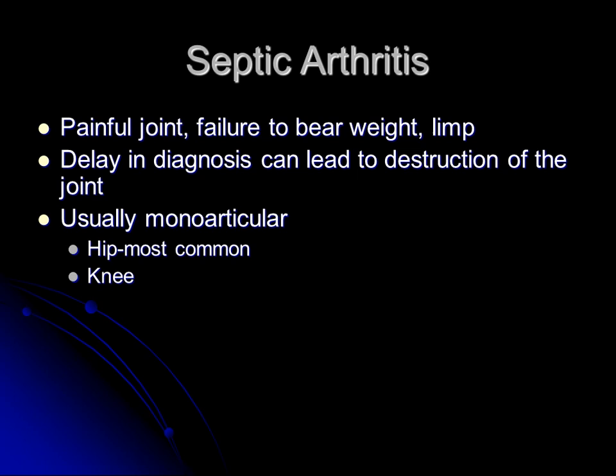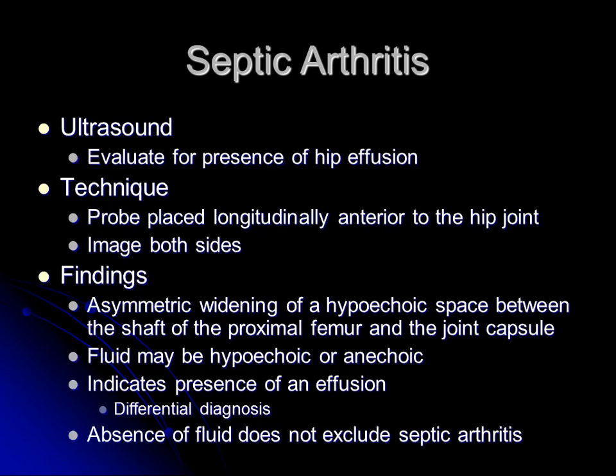Ultrasound is used to identify the presence of hip effusion using an anterior technique, going anterior to the hip joint to look at the femoral head-neck junction, which in a child is partly cartilaginous. I find it helpful to image both sides — I don't use an absolute measurement, I look for asymmetry. I like a buddy shot with both sides right next to each other. You look for asymmetric widening of the joint space between the shaft of the proximal femur and the joint capsule. The fluid can range from anechoic to hypoechoic, but the character of the fluid is not a predictor of the type of effusion — it just indicates the presence of an effusion.